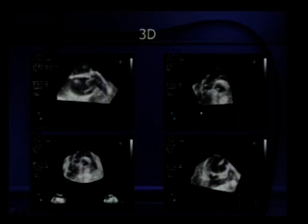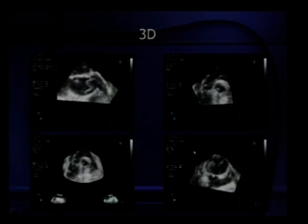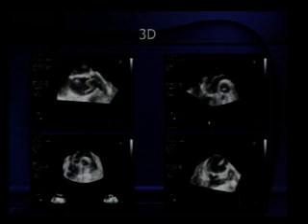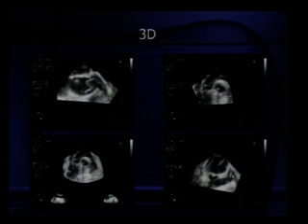This is a 3D echo of a patient with aortic dissection, and in 3D echo you can see the picture in any which way you like. You can turn the picture upside down, you can see the aortic side, you can see the dissection side, and each time the blood enters and hits this membrane, you can see how it's fluttering. So you can really get a very good idea of, look at this, the raised intima and the flap so clearly in three dimensions.